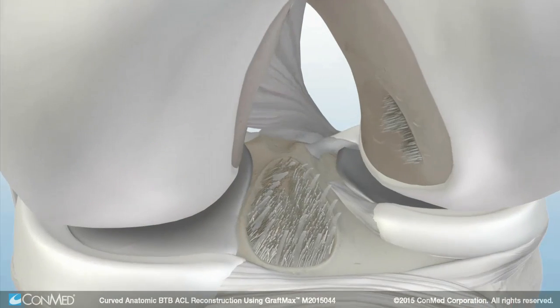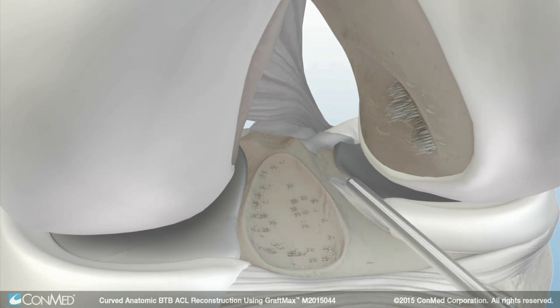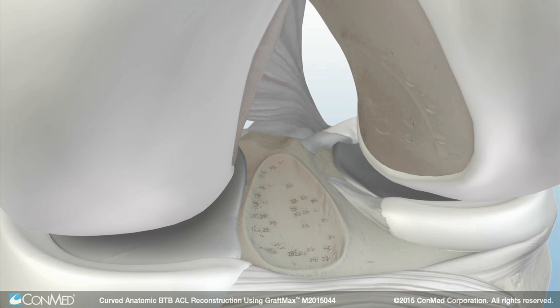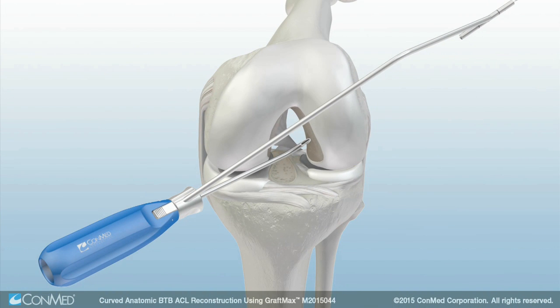To begin, debride unwanted remnant ACL tissue and mark the center of the desired tunnel locations. Then, insert the GraftMax curved guide into the anteromedial portal with the knee flexed at 90 degrees.